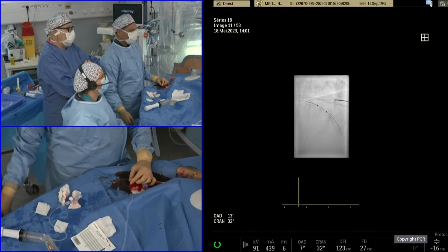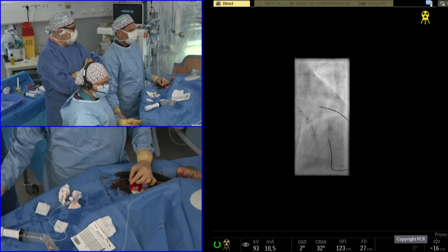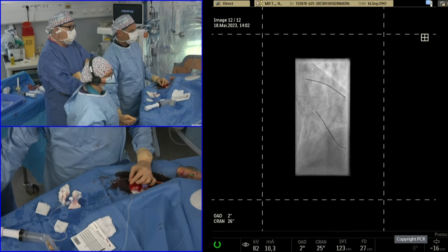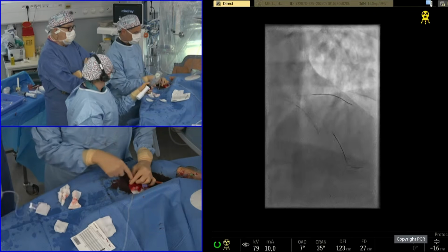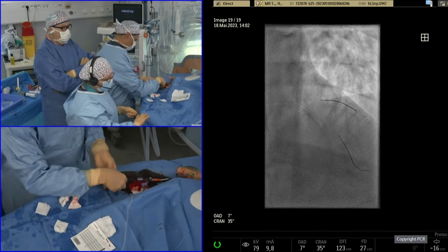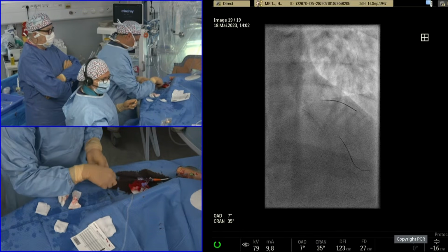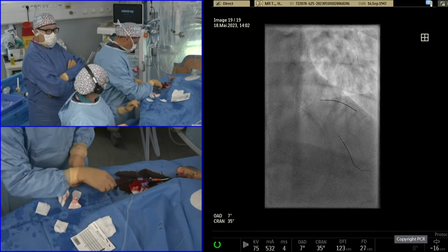Yeah, I think you did an excellent 3D study in Japan with OFDI that you documented. If you are guided by angio only, you are in only 50% of cases able to really cross the appropriate distal cell. You need to use imaging if you want to document that you really cross the distal cell, and then push that metal to scaffold the ostium of the side branch.